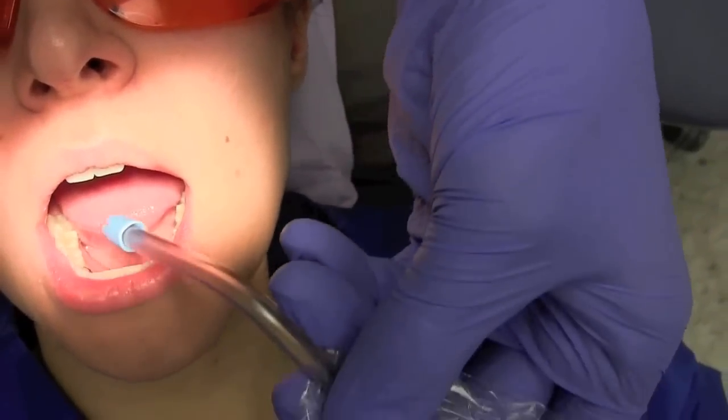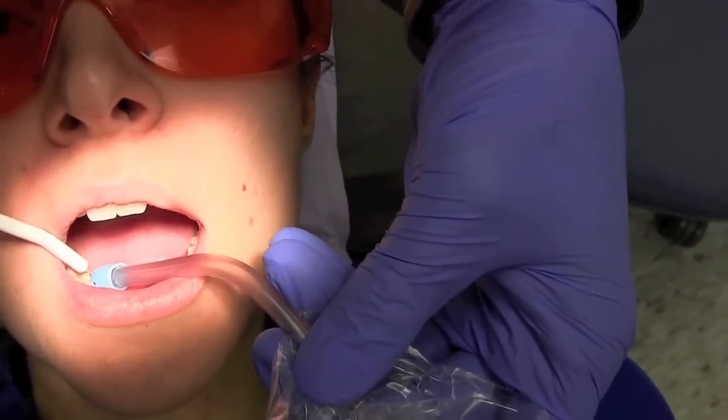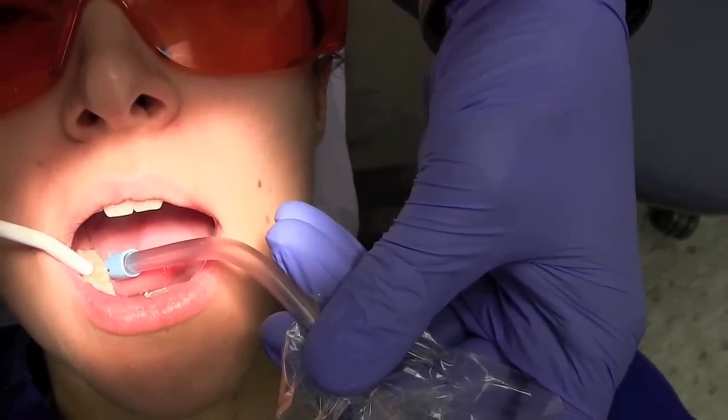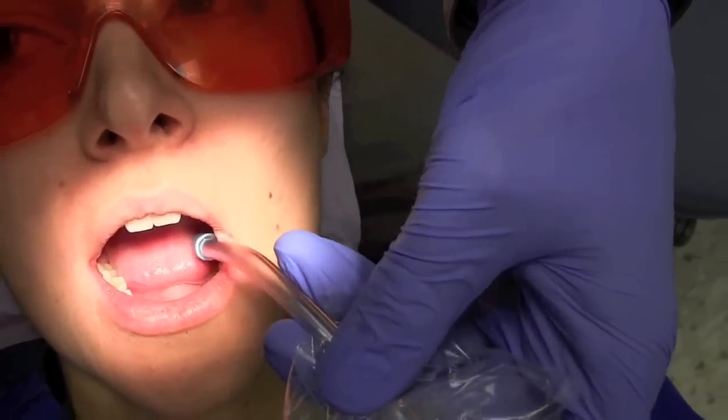And then we will rinse. Let's use the saliva ejector and some water. And that's it.